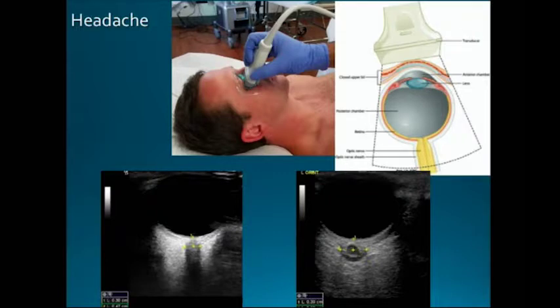They did studies with pigs and rhesus monkeys, where they would artificially jack up their intracranial pressure and watch the optic nerve sheath get big, and then they would drop the pressure and watch it in real time shrink back down.